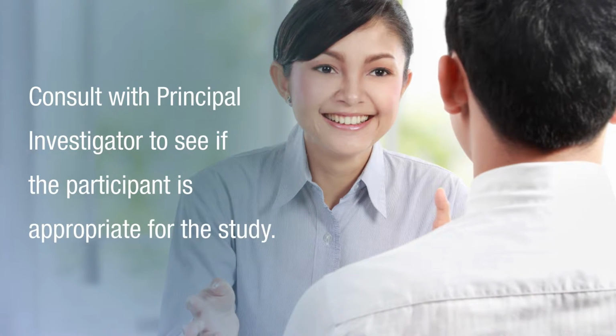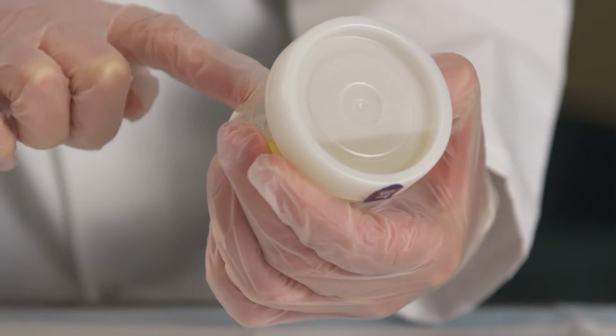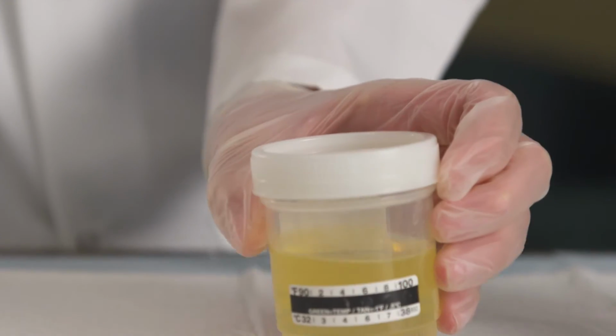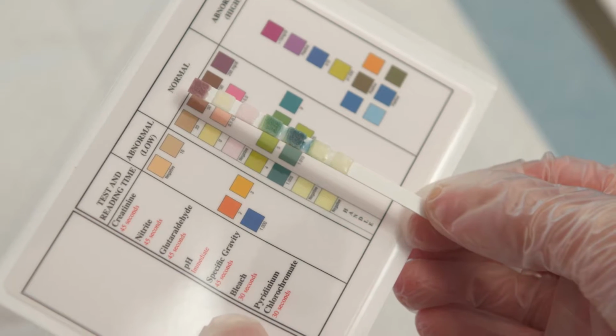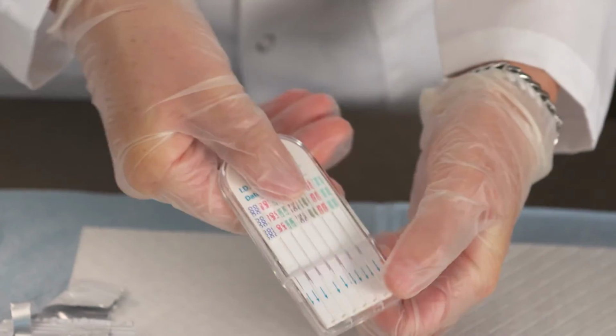If multiple adulterated samples are provided during a screening phase, you may want to consult with a principal investigator about whether that participant is appropriate for this study. After confirming that the urine temperature is in range and the sample has not been adulterated, proceed with the urine drug screen test by removing the 10-panel Quick Tox dip card from its package.